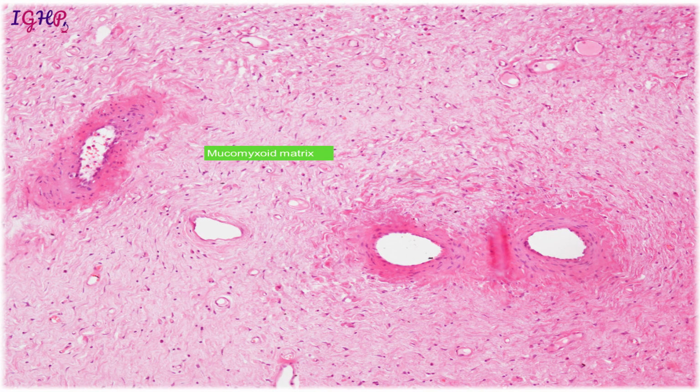But again in this you see these cells which are scattered in this bluish mucomyxoid type of matrix. So when the matrix is being produced in the soft tissue, it is called a myxomatous matrix, and this myxomatous matrix is distinct from what we saw as mucin in the epithelial cells. So if you see a bluish hue in a connective tissue, you should think of a mucomyxoid change, and again this is being produced by the fibrocytes which are seen scattered here.